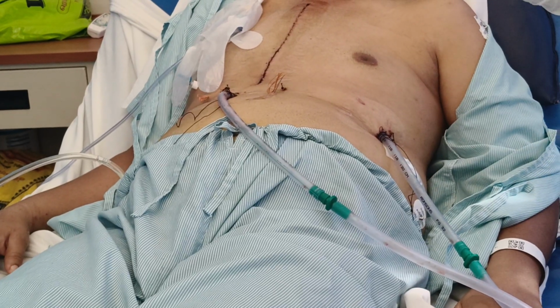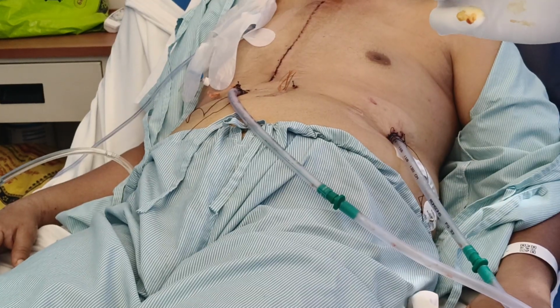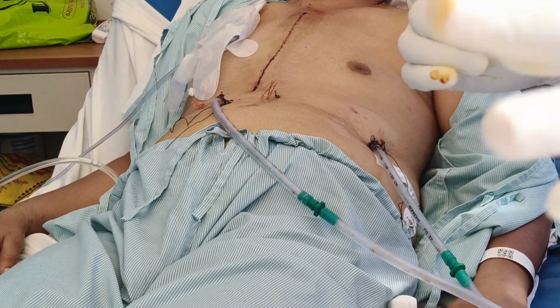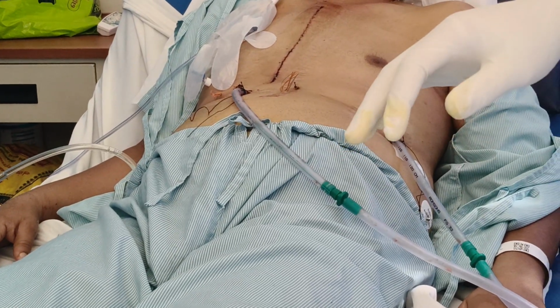Usually in a day, pleura will secrete around 100 to 110 ml of pleural fluid. So if drain output is 100 to 110 ml, it's okay. If drain output is grossly more than 150 ml, more than 200 ml, you should not remove a drain.